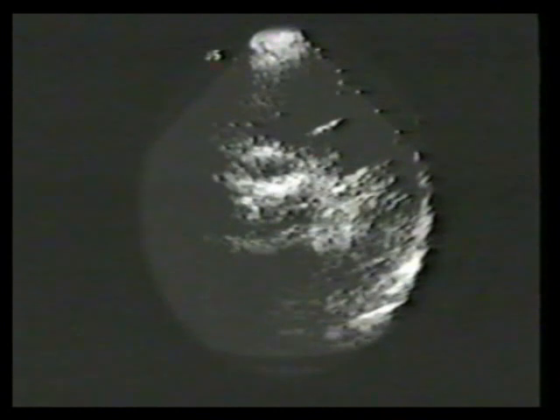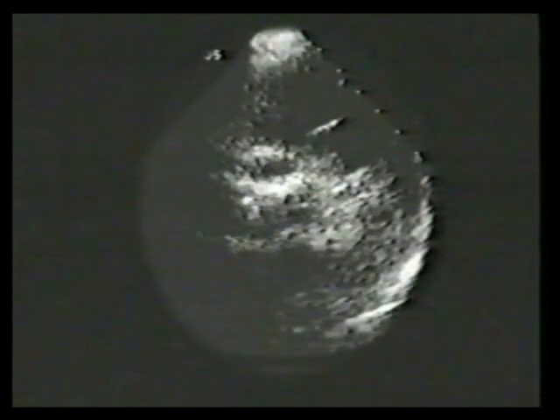This 48-year-old male was referred with end-stage aortic stenosis, which had resulted in severe reduction in LV function and severe pulmonary hypertension. This is the densely calcified aortic valve, and this is the left atrial appendage. Attention is being directed to the pulmonary valve. In real time, pay attention to the quick, bouncing motion of the valve cusp in systole.